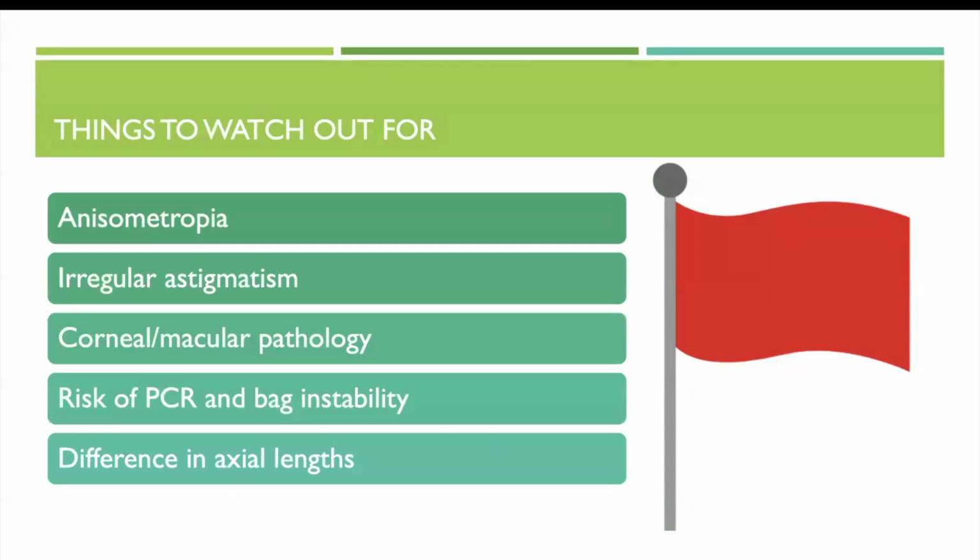So things to watch out for, and we've already spoken about this, but it's just to finish on what you're considering and remembering to consider when looking at these patients in terms of counseling them and what to consider when it comes to your lens choices.